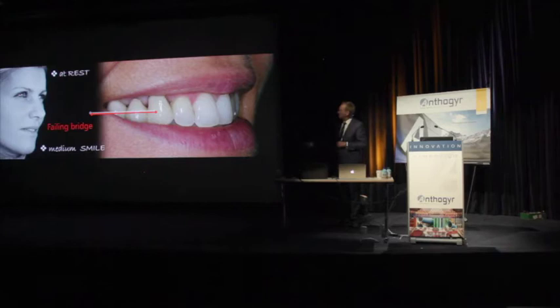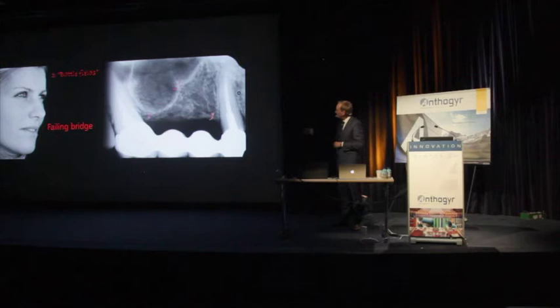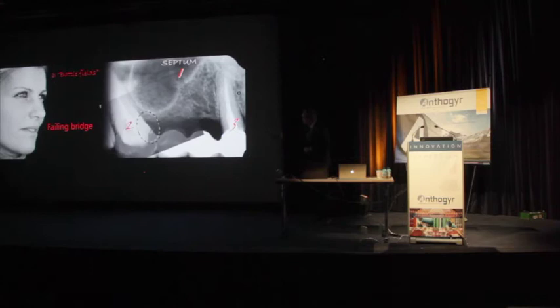2 missing premolars, a big concavity, a big sinus with 2 septum. You see the molar is not the first molar, but the second molar tilted forward. So we have different problems. You see the angular bony defect. This tooth needs uprighting. We cannot do that orthodontically because of the dense bone structure.